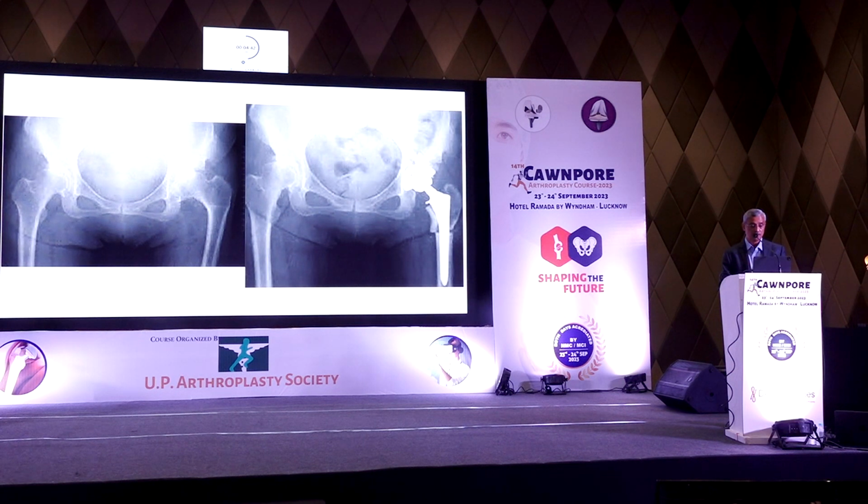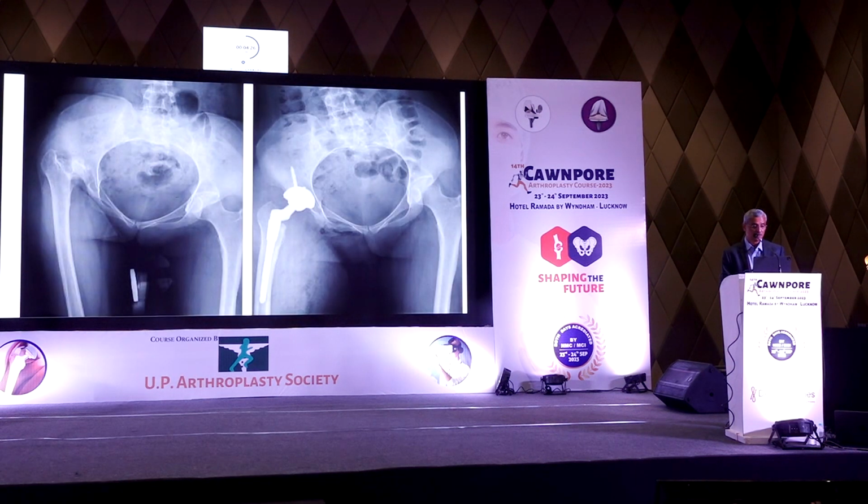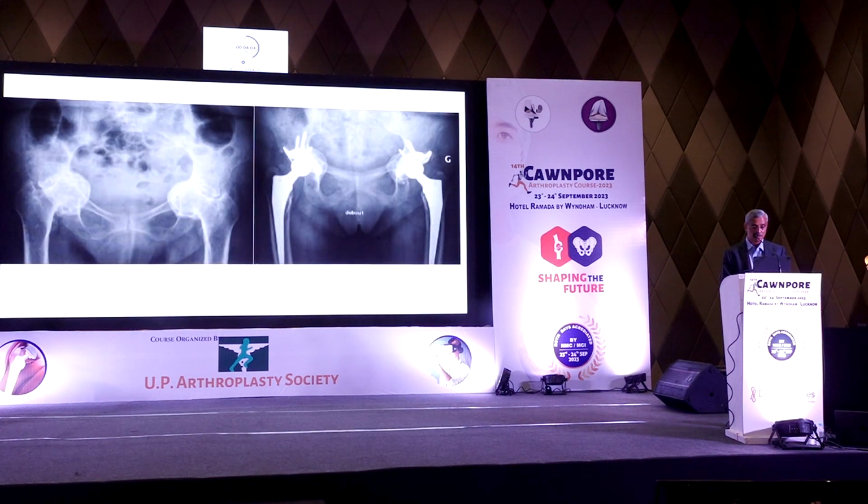So here's one Coxa vara that was not a conventional sort of Coxa vara. It was due to an old proximal femoral osteotomy, which you needed to correct to get the limb length, the offset, and the restoration of the biomechanics of that particular hip. So this is a post-iatrogenic sort of Coxa vara. These are commonly the situations that we see, post-septic sequelae that have a very high riding hip, and to get that down, your modular hips are very, very useful. And here the offset has been very well restored, and so this hip will do very well. This patient will have very good function.